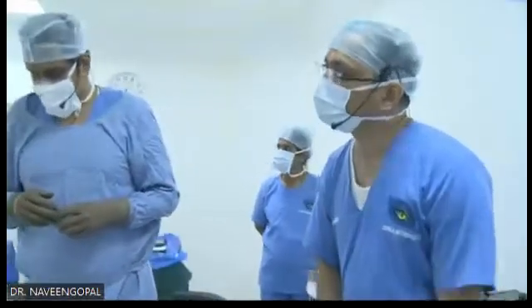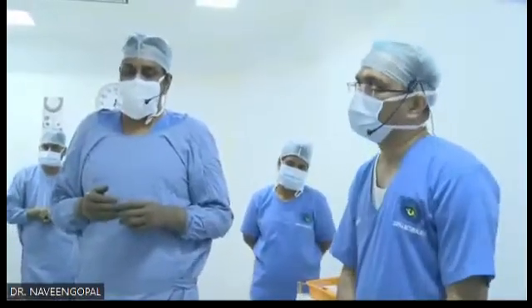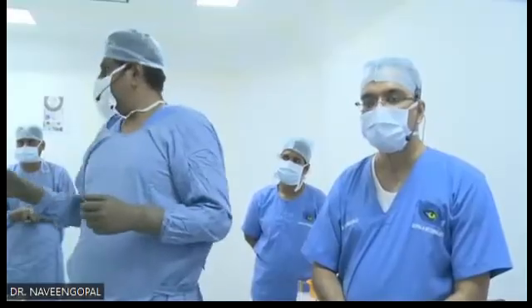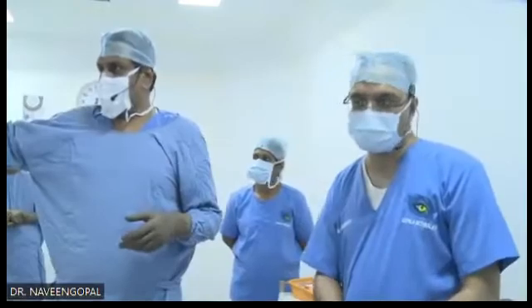Thank you very much for pointing that out. We have the acrylic phakic lenses available from +10 to -25 diopter, and in phakic toric also we have a range between +8 to -25. So there are a few advantages with Indian phakic IOLs.